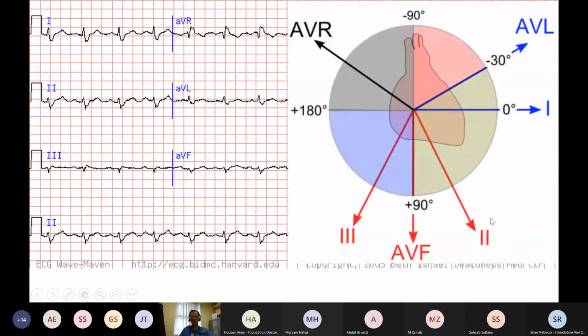It's important to be aware that the ECG is looking at the heart from a number of different directions. And I like to wave my arms in the air, which you won't get so well when we're not meeting in person, but I like to hold my arms up like this. If you do that and embarrass yourself a bit, it's always good to embarrass yourself a bit when you're trying to learn something because people remember being embarrassed. Your right arm is looking like AVR at the heart.